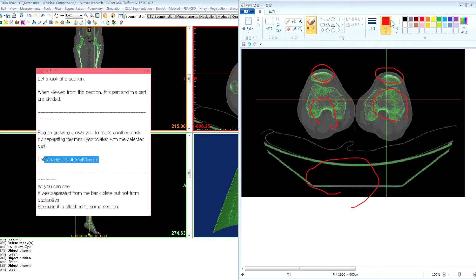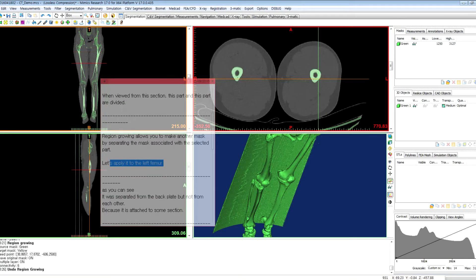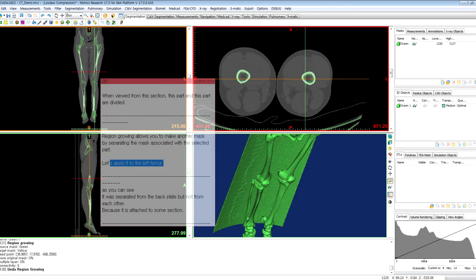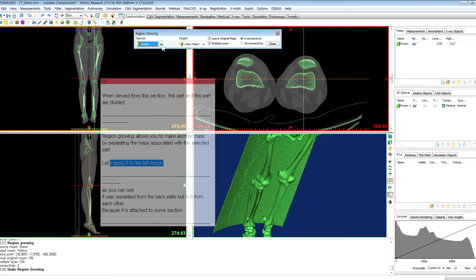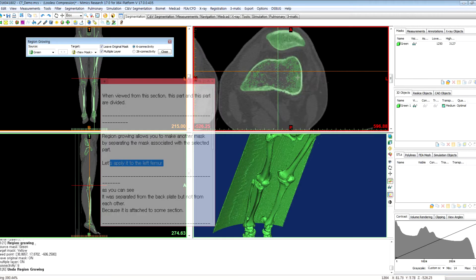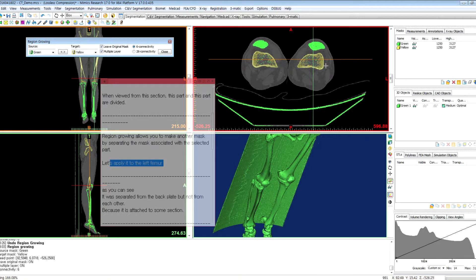Let's apply it to the left femur. Choose the femur part here, like this, and click region growing. Check if the source mask is green, and choose the part of the left femur, like this. As you can see, it was separated from the back plate and patella, but not from each other, because it is attached to some section.